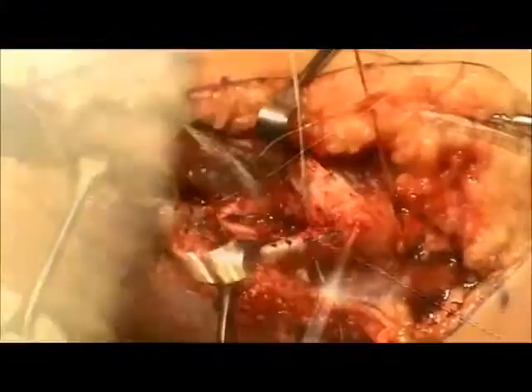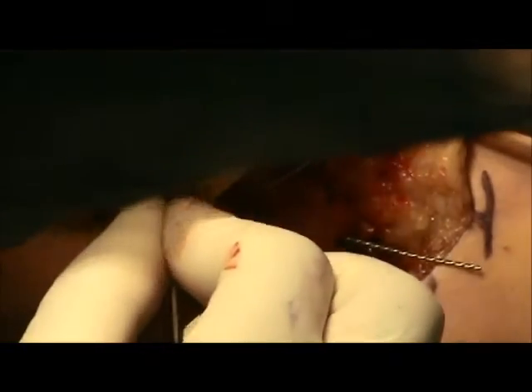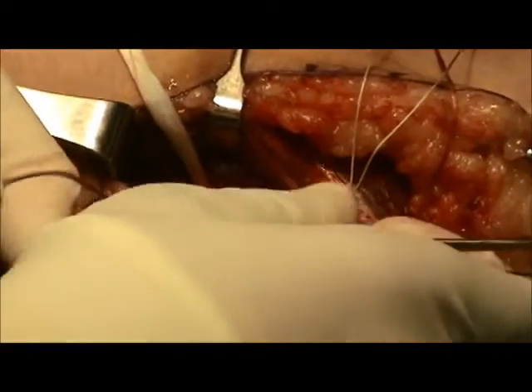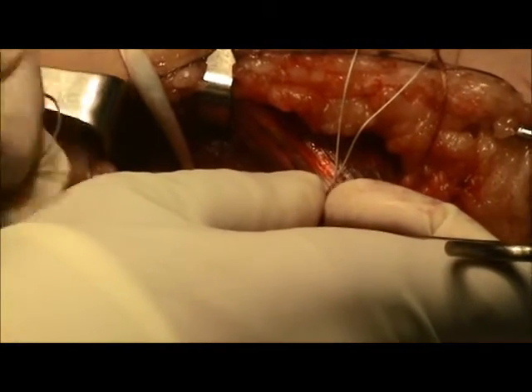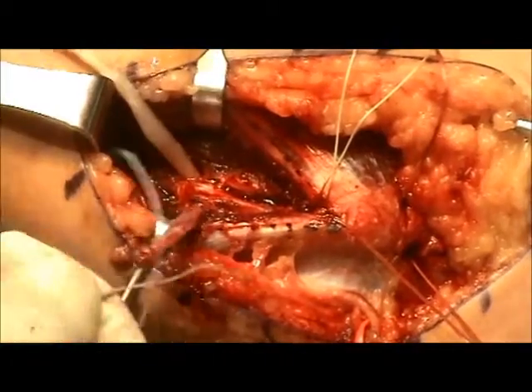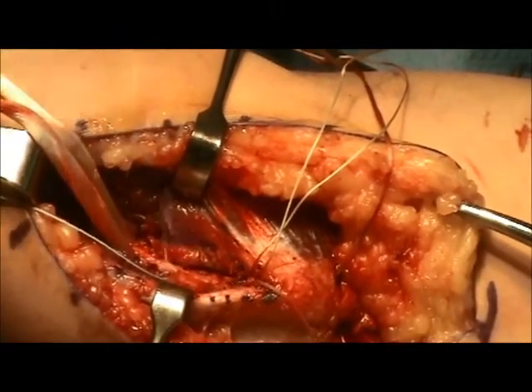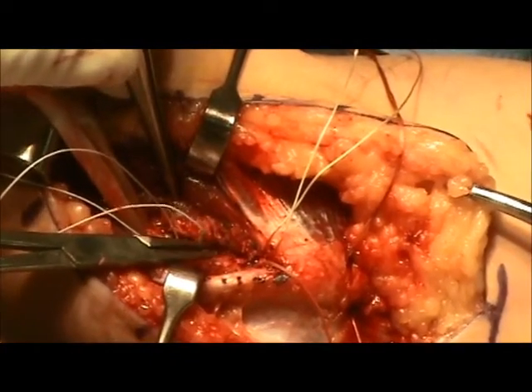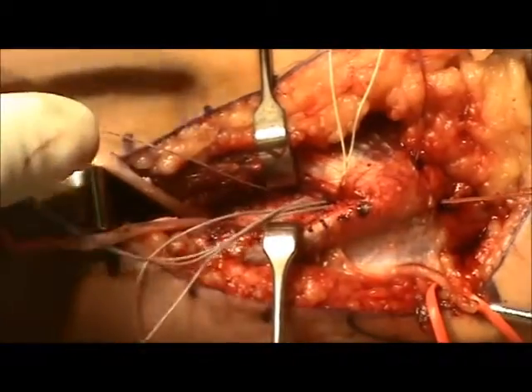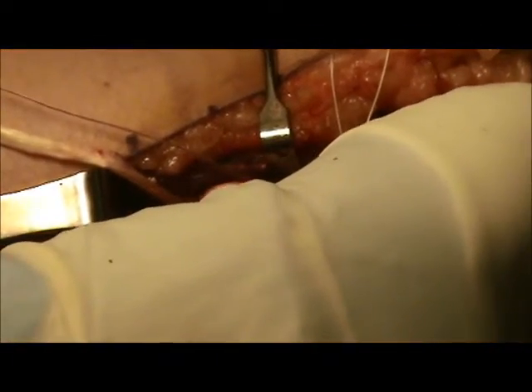Similarly, this is performed for the posterior exit tunnel, and here two suture shuttles are achieved. Next, the graft is passed, first from anterior to posterior. Care is taken to avoid excessive traction on the graft that could injure the bone bridge. Once the graft is passed, the native ligament is repaired with a 0 or number 1 non-absorbable suture. Multiple interrupted sutures can be placed, or a single suture in a running fashion to repair the native ligament. Next, the posterior limb of the graft is passed through the epicondyle by shuttling the graft suture. The suture is tensioned, delivering the graft into the epicondyle.